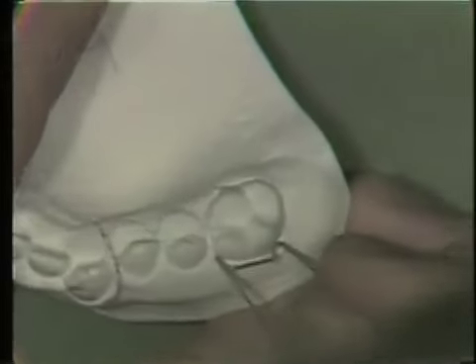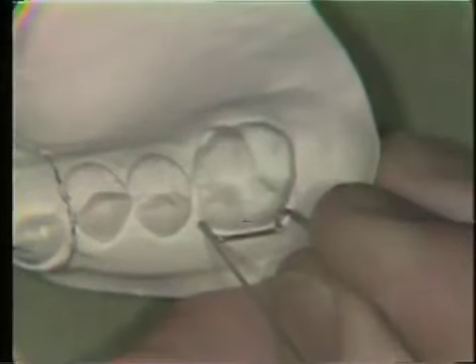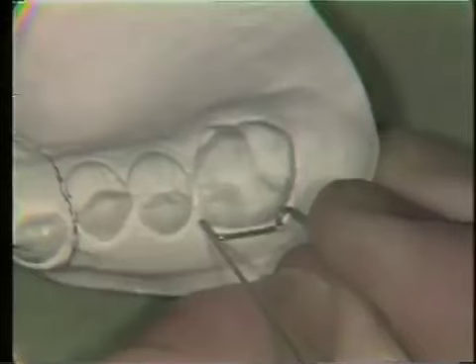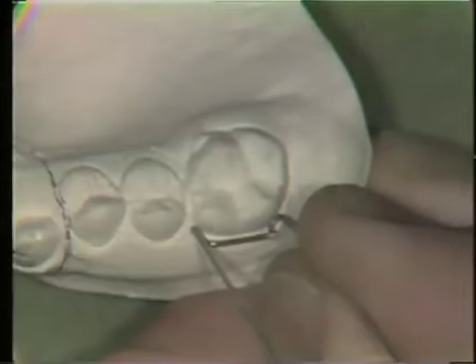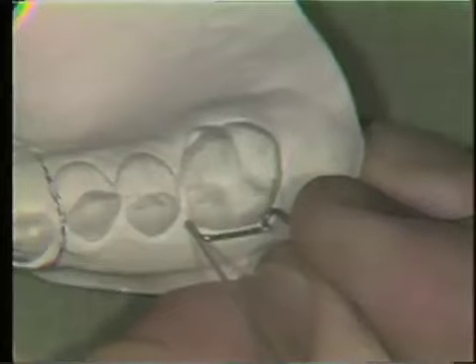The wire is tried back on the work model, and the small loops should engage the prepared undercut areas on the buccal surface of the teeth. Only the ends of the loops touch the tooth. The crossbar portion — the straight portion between the two loops — is about a half a millimeter away from the buccal surface of the tooth.